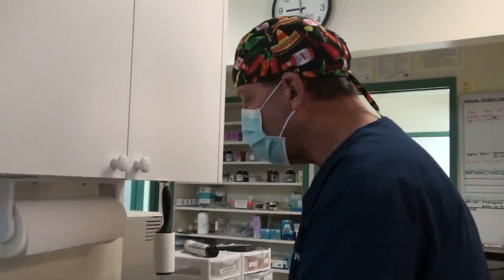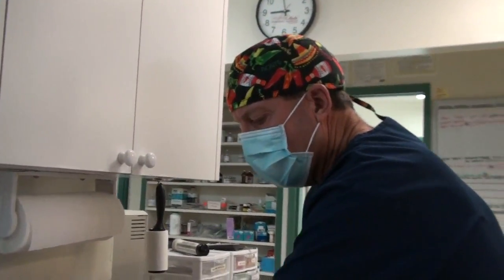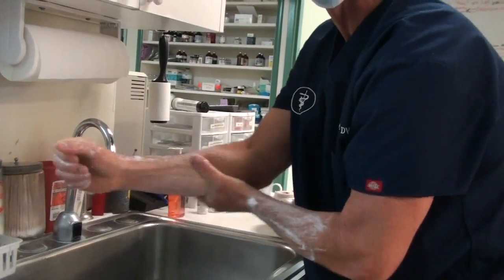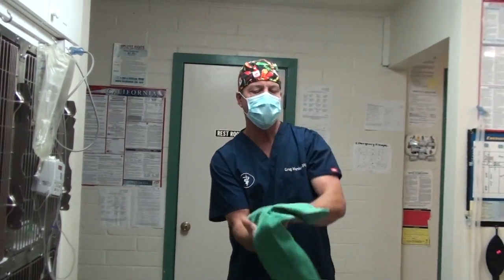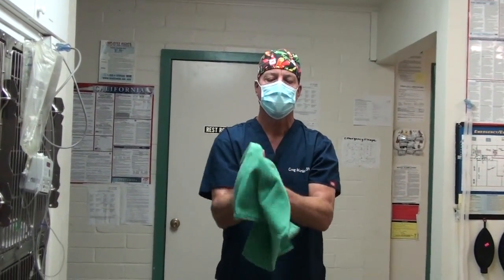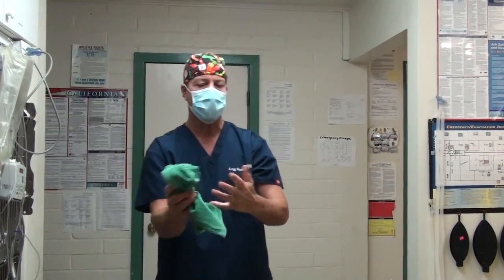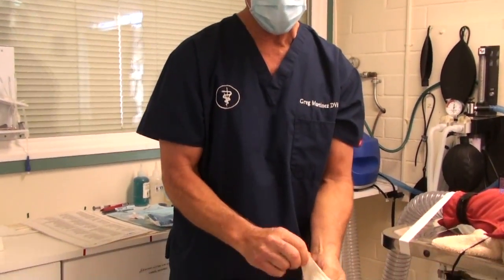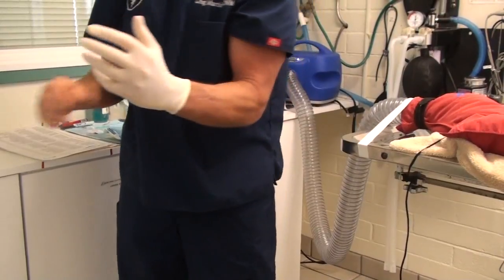It's all prepped and ready, and now it's time for me to scrub all my bacteria off — scrub three times — to get nice, clean, and sterile. We dry our hands with a sterile towel, then put on a sterile paper drape. Now I make sure my hands are just as sterile as they can be for the surgery. Putting on gloves is important; you can see the glove lining, and you put your gloves on without touching the sterile surface.